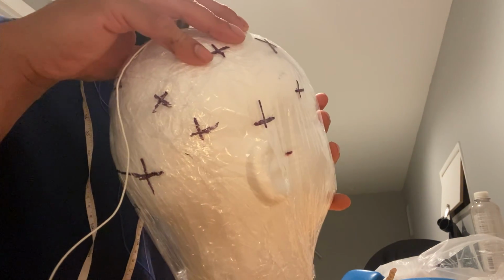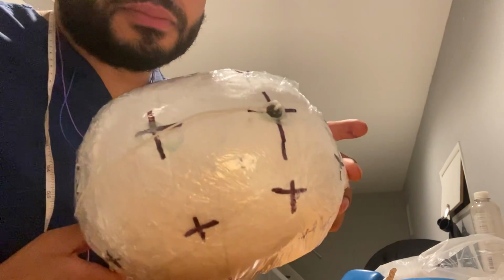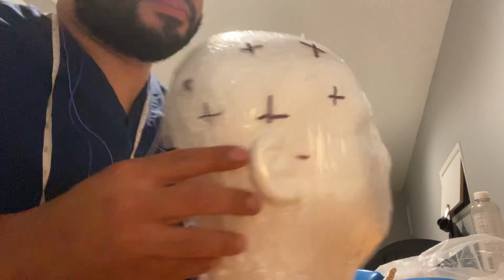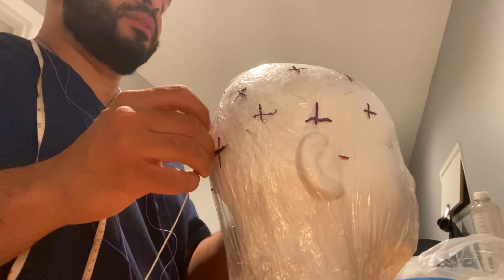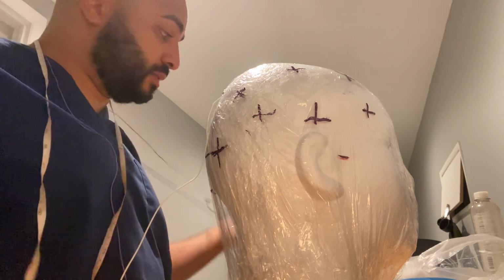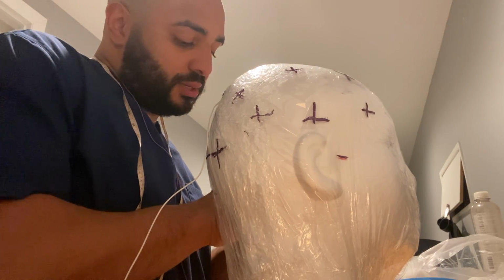I'm going to hit it with the white tail, press down so that 10-20 comes through the center. I'm going to go for CZ. And these will go in the box accordingly, FZ, CZ, PZ.